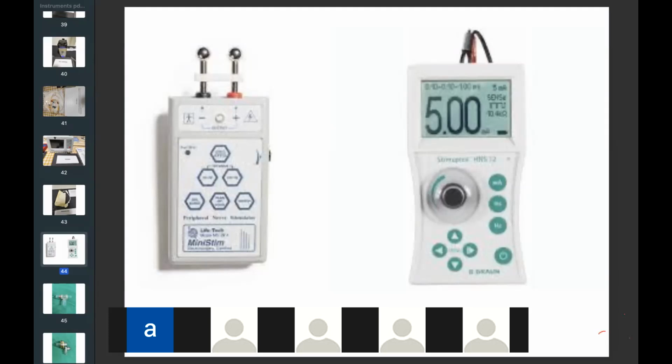In case of non-depolarizing muscle relaxants, we can see the twitches, they progressively fade. And in case of the depolarizing muscle relaxants, the fade pattern is not seen. So that's how we differentiate between non-depolarizing muscle relaxant and the depolarizing muscle relaxant using the peripheral nerve stimulator.